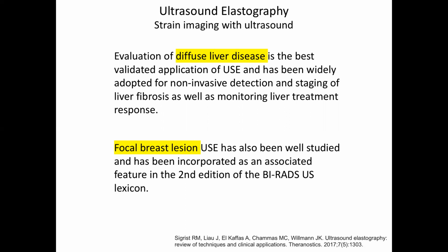Or if you're going to take that thing out surgically, and it's a small lesion where you can just do a partial mastectomy, so you want to take the tumor out and leave no tumor in there, you can put a marker wire.